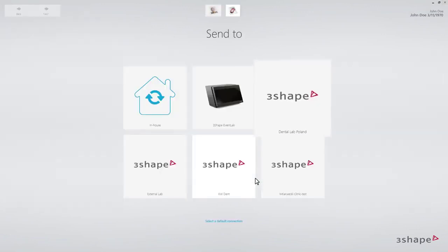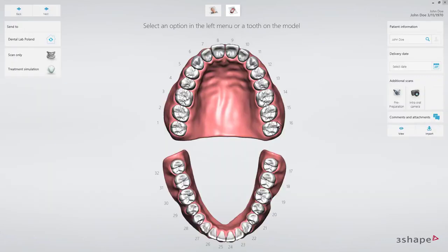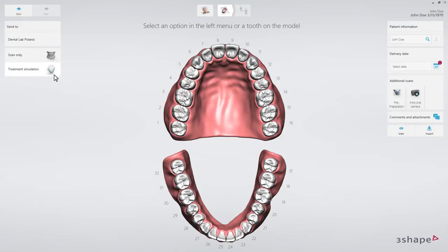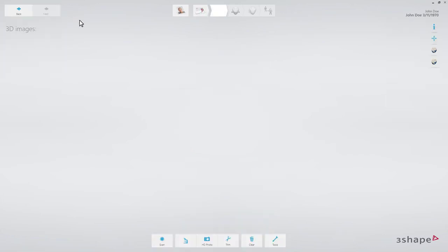Select a lab. The order form will now appear. Select Treatment Simulation. Proceed with the Trios scan according to the recommended scan strategy.